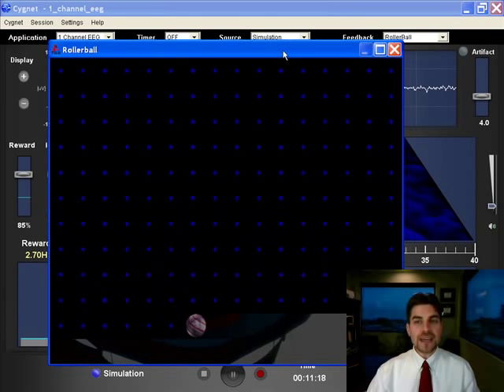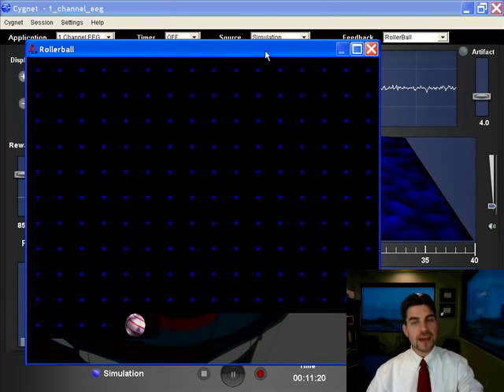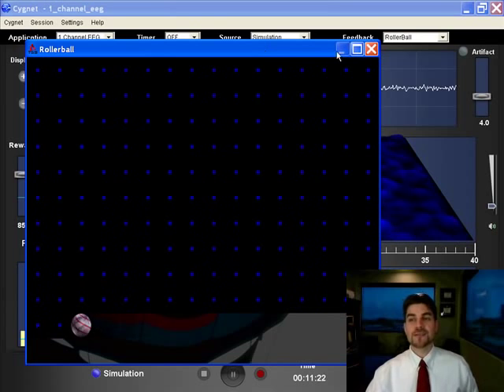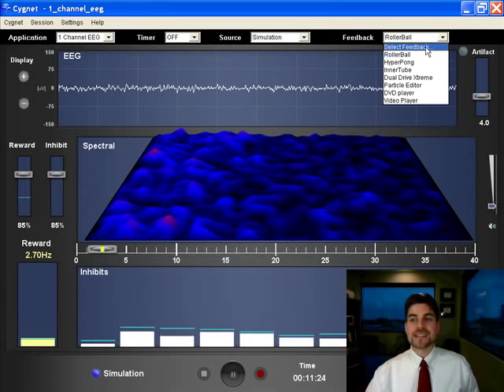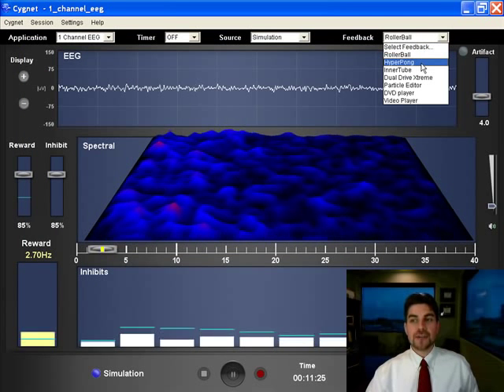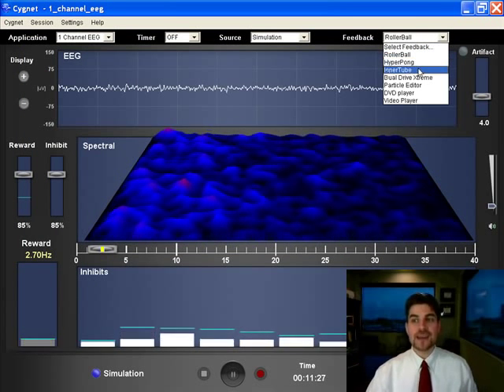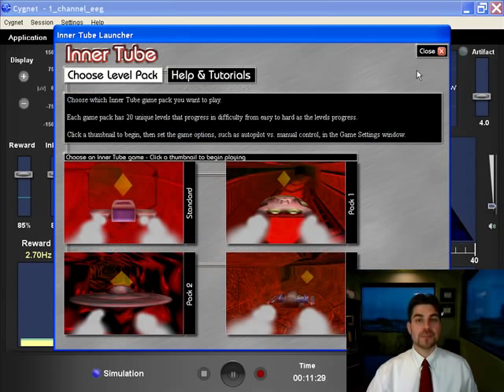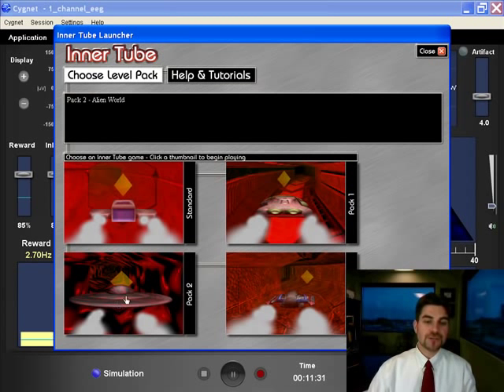Now, notice without even closing this game, I could have this game running on a second monitor for this client. I can go in and select another game without pausing or anything and I can choose inner tube, for example. Up comes my selection of rockets.